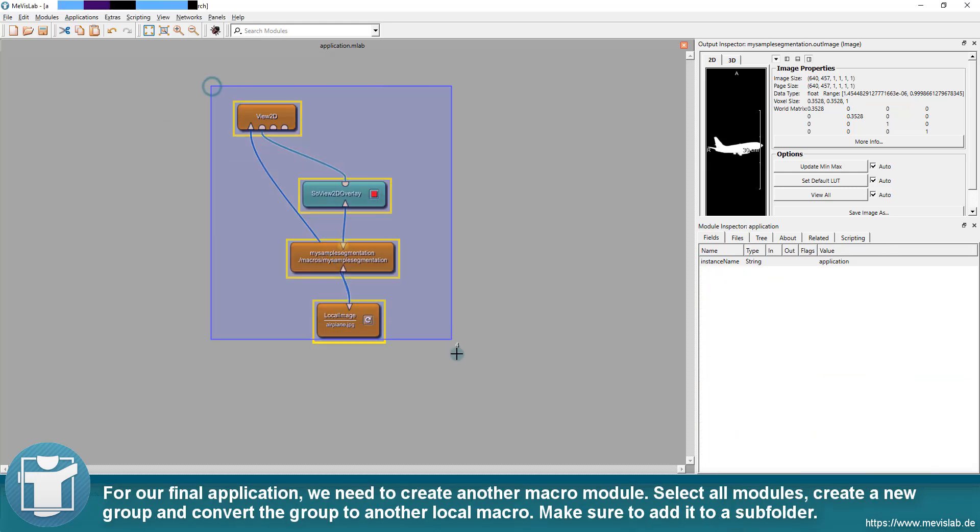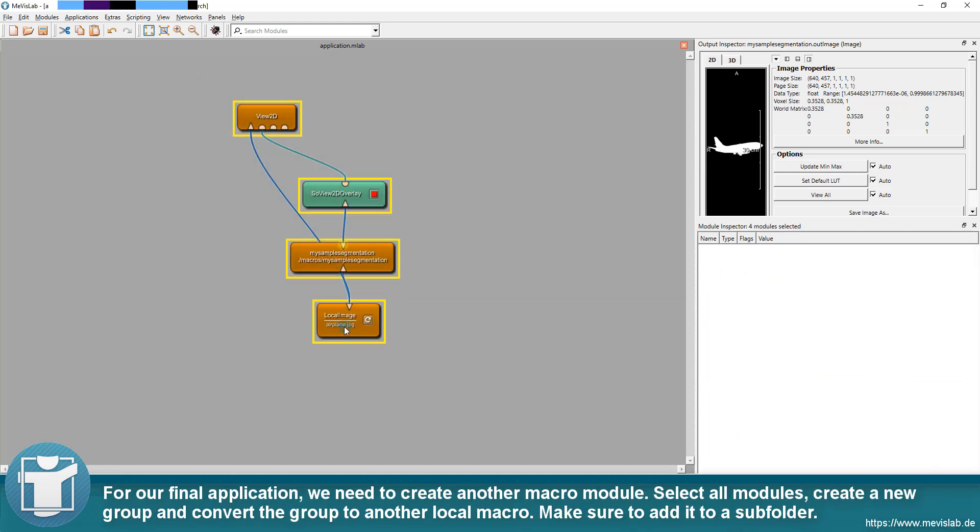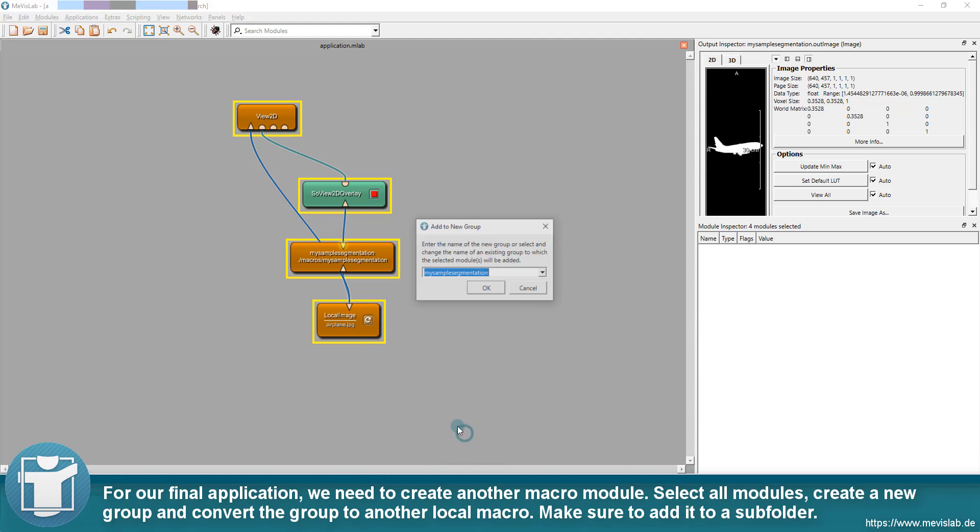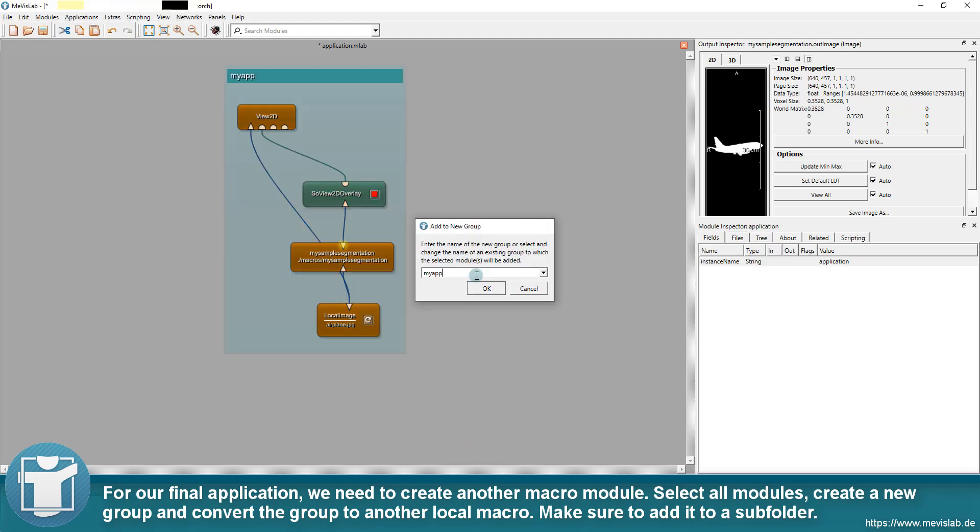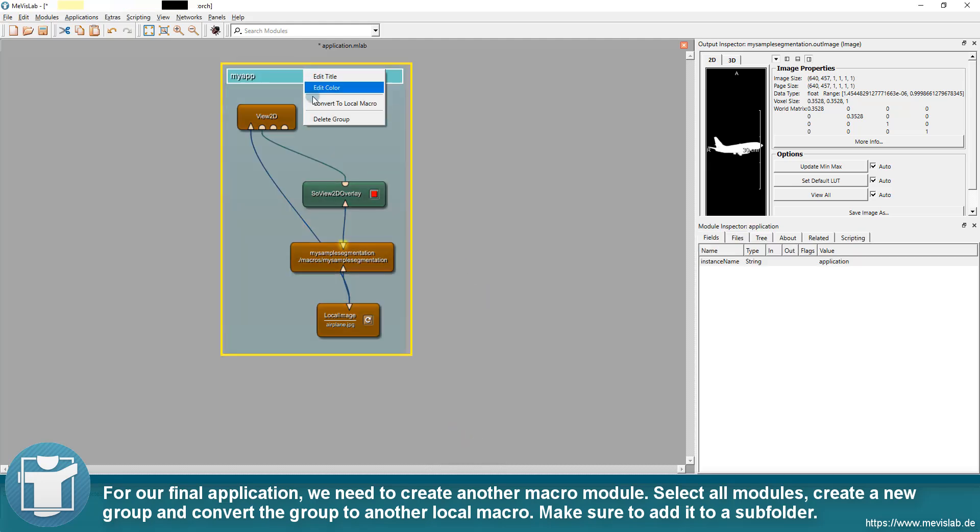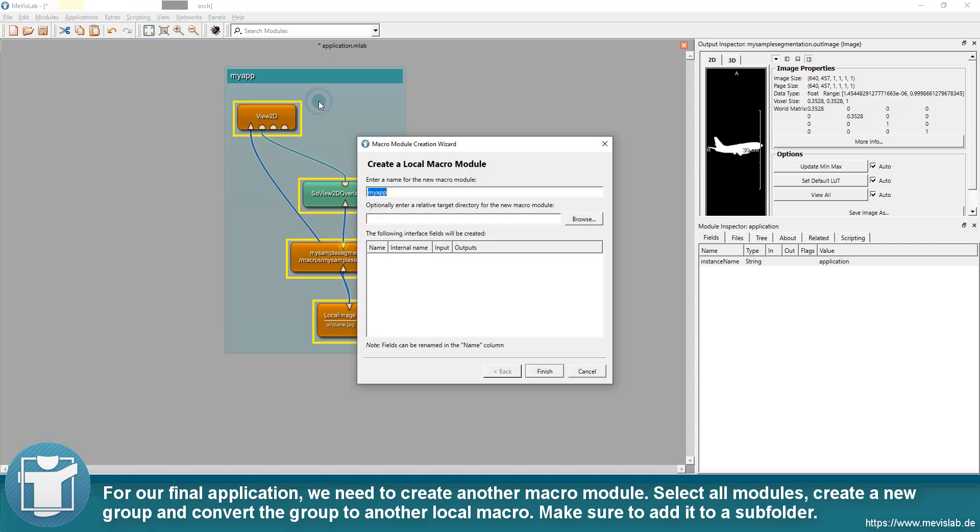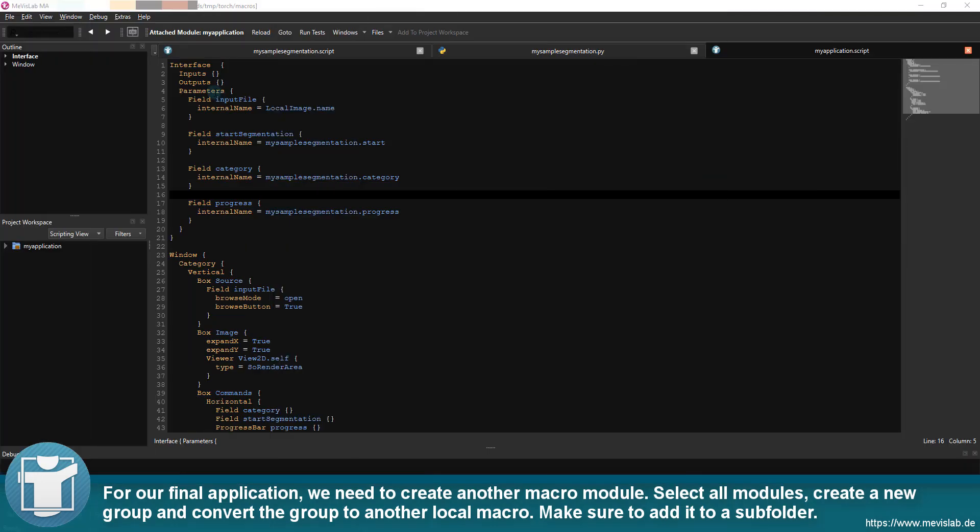For our final application, we need to create another macro module. Select all modules, create a new group and convert the group to another local macro. Make sure to add it to a subfolder.